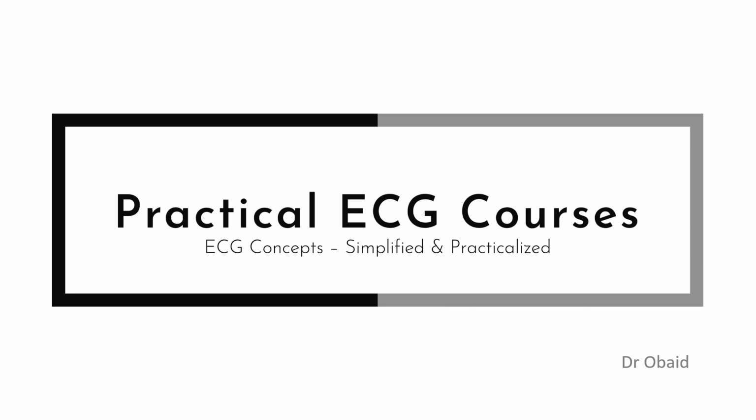When I talk about concept-based approach to ECGs and deductive analysis, people are often confused and they ask me what that means and how it is relevant to them. So the idea behind making this video is to introduce you to concept-based approach to ECGs and to show you how it can change your practice.